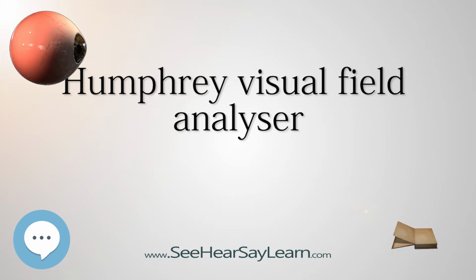Pattern standard deviation, PSD, is derived from the pattern deviation and thus highlights focal loss only. A high PSD, indicating irregular vision, is therefore a more useful indicator of glaucoma progression than the MD. Glaucoma Hemifield test, GHT, provides assessment of the visual field where glaucoma damage is often seen. It compares 5 corresponding and mirrored areas in the superior and inferior visual fields. The result of either outside normal limits, significant difference in superior and inferior fields, borderline, suspicious differences, or within normal limits, no differences, is only considered when the patient has, or is a suspect for, glaucoma. This is only available in 30-2 and 24-2 analyzer protocol.